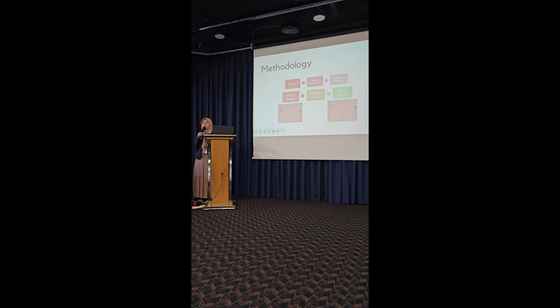The input images for testing data we collected from a hospital. I have 10 images for testing data, and then we can see this final result. We can see the bounding box and also the confidence value.